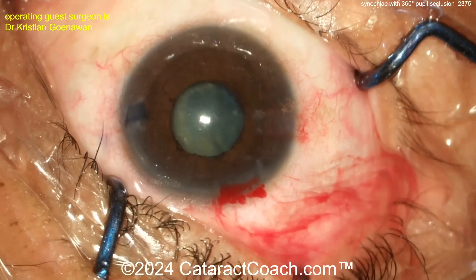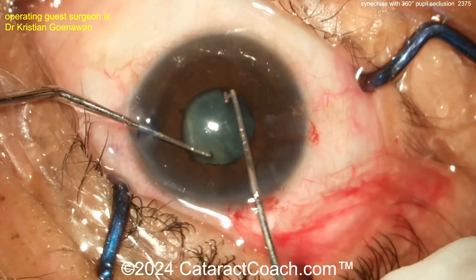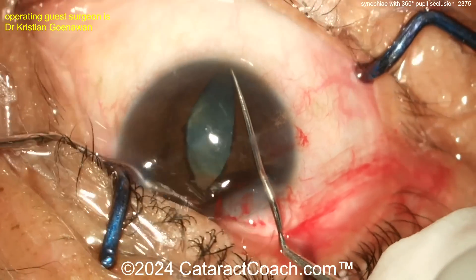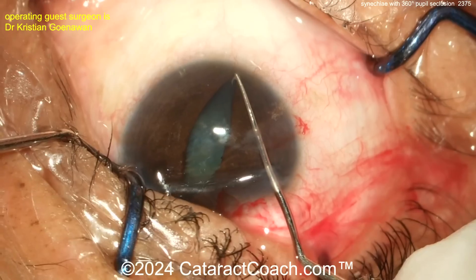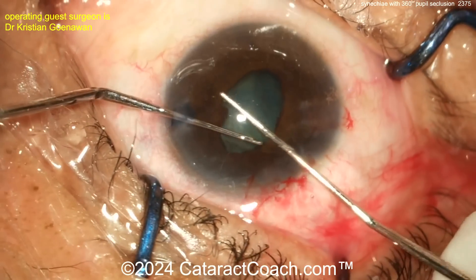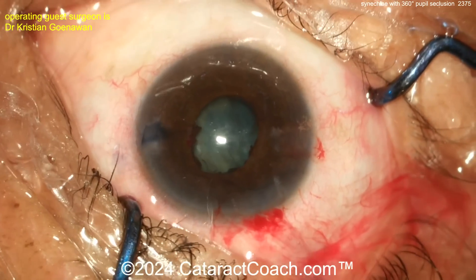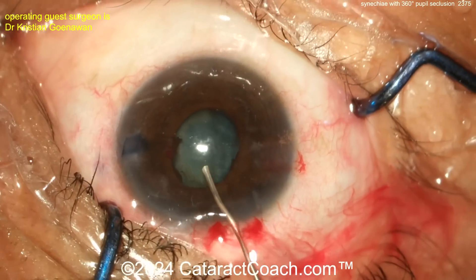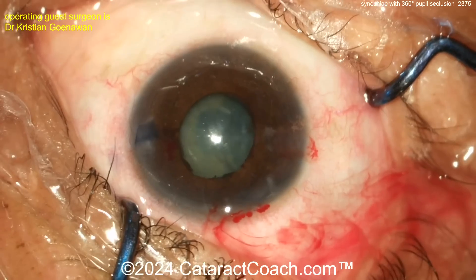In a patient like this, also make sure you get good anesthesia — a peribulbar, retrobulbar, or sub-Tenon's block. It looks like an iris push-pull in one hand and a chopper in the other. Again, be very careful not to damage the lens capsule — that's critical here. I've seen residents inadvertently puncture the anterior lens capsule while the pupil stretch is going on.